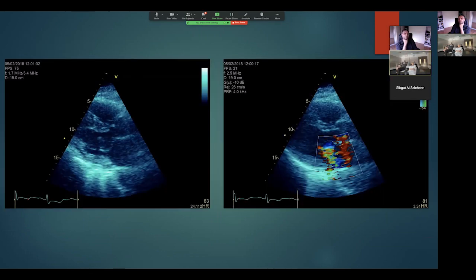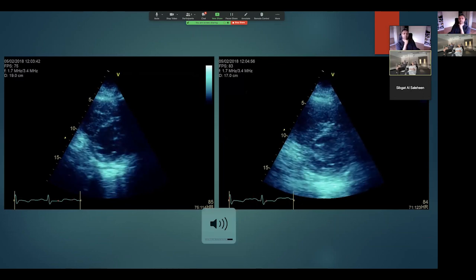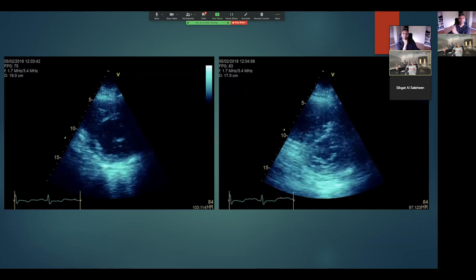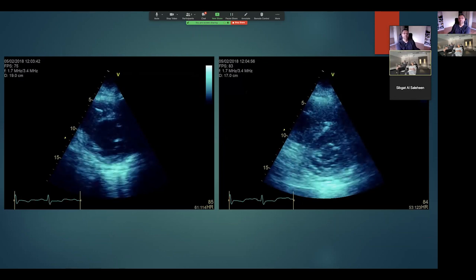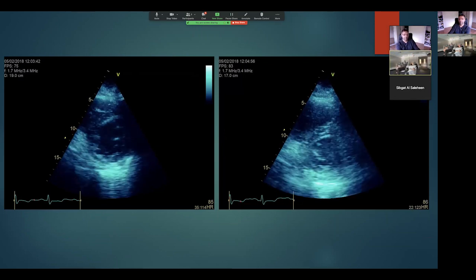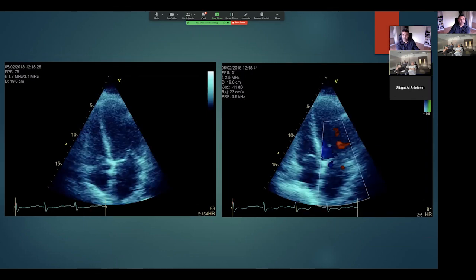Go back one. Sorry. Just have a look at that. Sorry, what I'm looking at, the regional wall. Cover the top and look at the bottom. Yeah, gotcha. And then compare that to the one at the top. Just to get you on the right track. The septal movement's okay. It's probably just not coming out brilliantly, it's pretty jumpy, Vishal. Right, okay. I'll go to the next one.